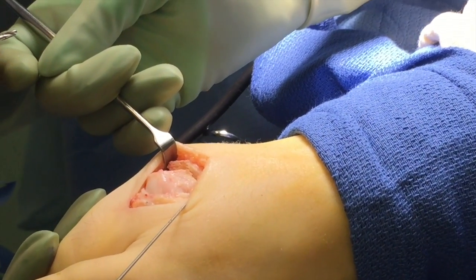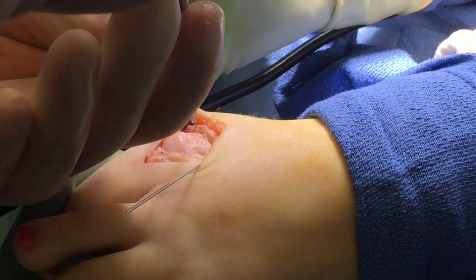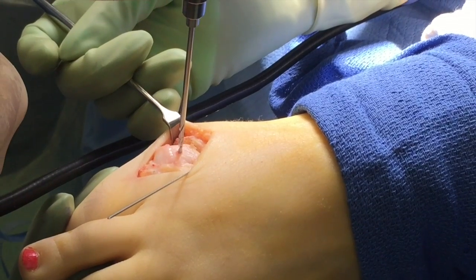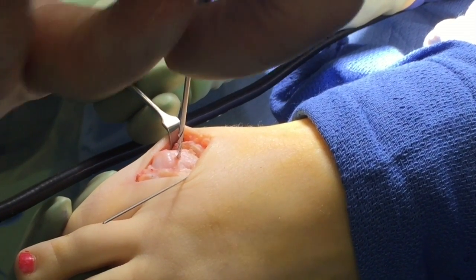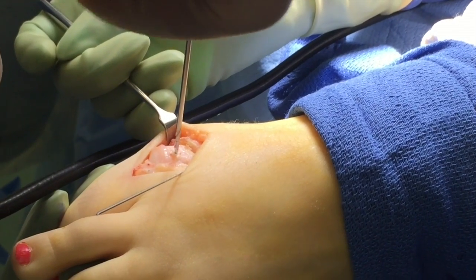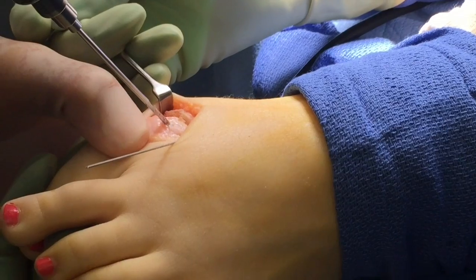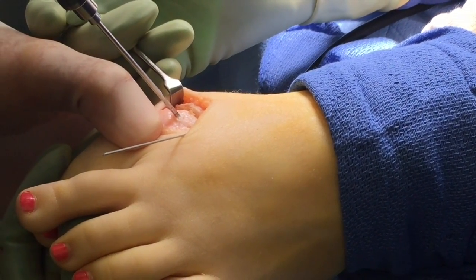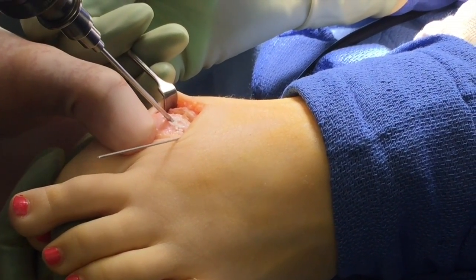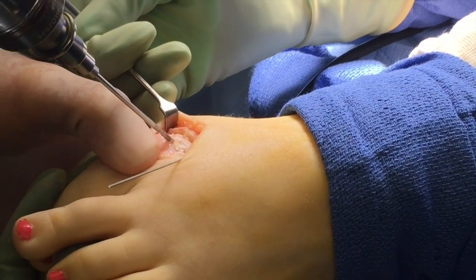Now we're ready to drill the portals to receive the bone pin. I'll drill straight up and down to do the first one just to get it started. Once we get it going, I angle it down, and the first pin — this is the medial pin — exits the plantar cortex. I do a little pistoning so it won't get hung up.